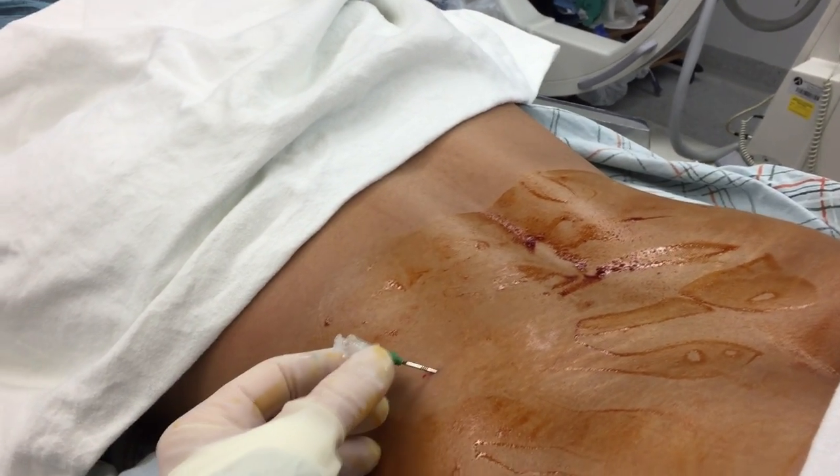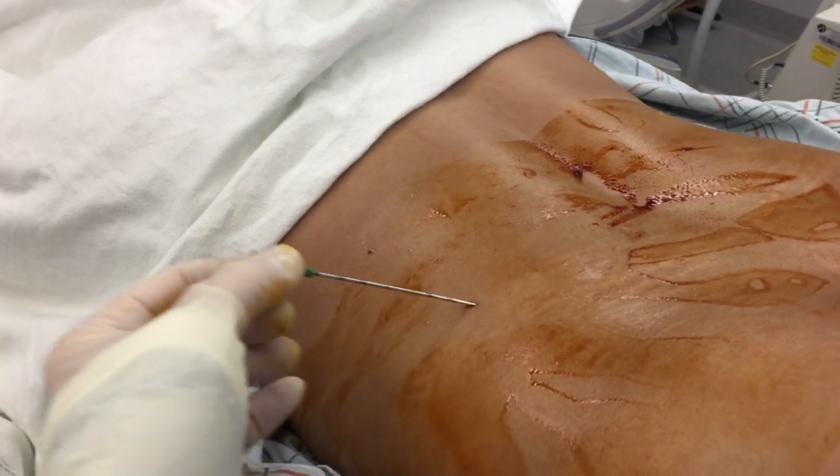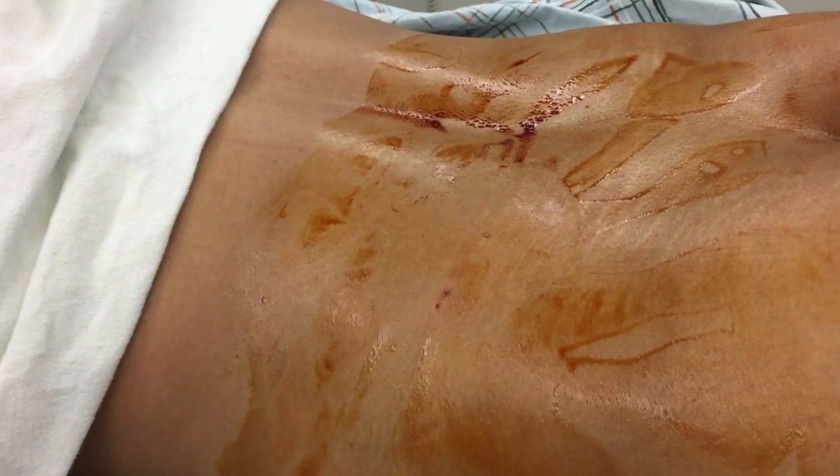The treatment is done. We have a little needle here that we're just going to take out. You see — no incision — and that'll heal and it'll be like nothing ever happened.